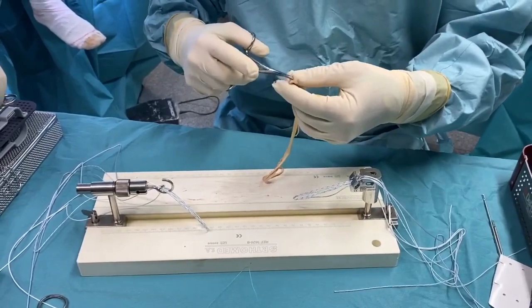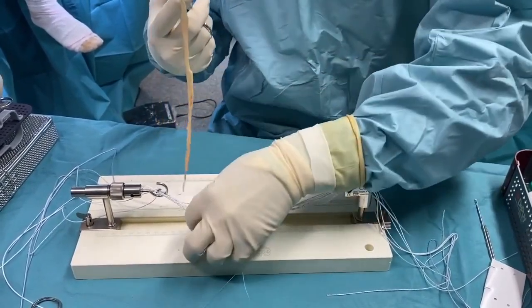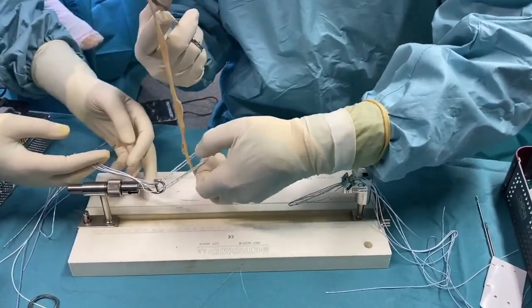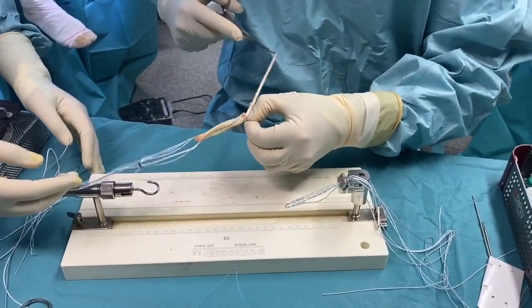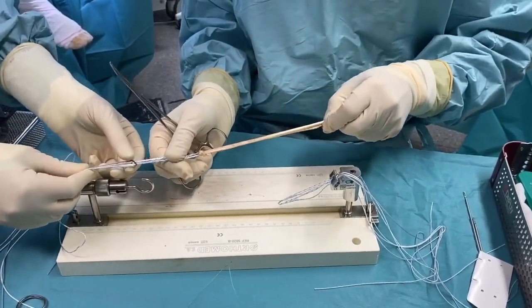To create the lasso loop, a clamp is placed in the incision to recover the other end of the tendon, once it has been threaded in the loop of the end of the button. Then the loop is tightened by pulling the free end of the tendon, so that it is solidly attached to the end of the button.